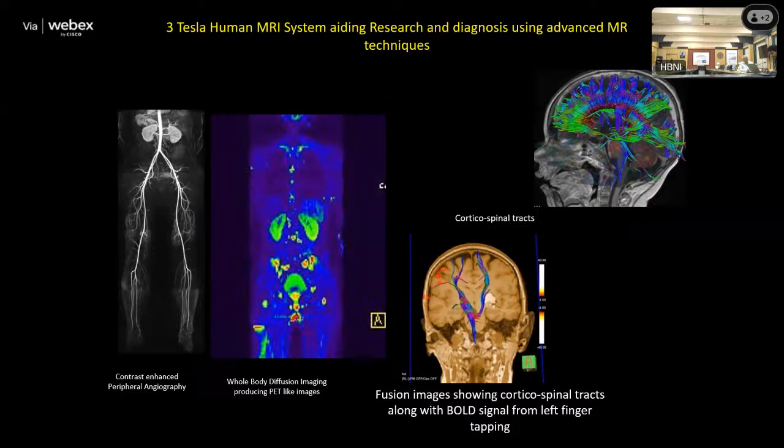But sir, I just want to know how you image the heart, how it is done experimentally, because you already have a system like the ribs and the muscle. How do you select the image of the organ which is located there? I told you, the beauty of MRI is you can cut the slices in any plane, any orientation. And for the people in nuclear medicine, they know the heart is best visualized at a 30 degree LAO angle.